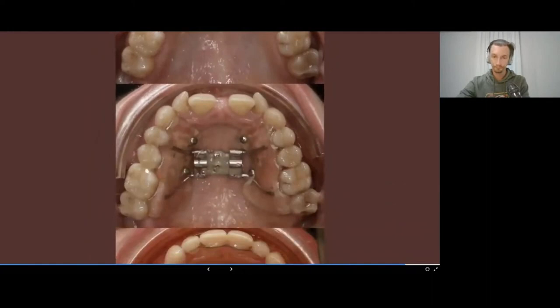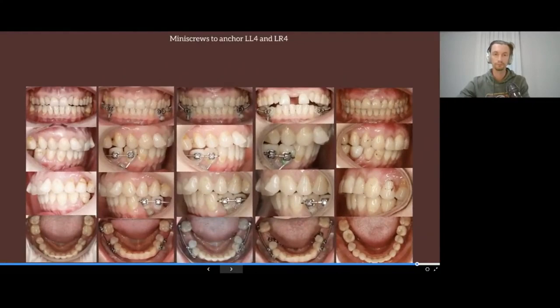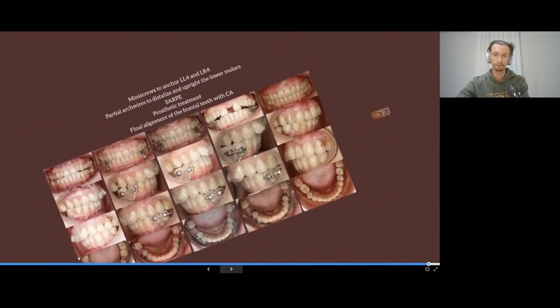During the expansion and the final result: it's only necessary to move the lateral incisors with aligners, and that's it. The stages with mini screws were: stabilize the posterior segments on the lower jaw, distalize second molars on the lower jaw, level them in the occlusal plane, perform surgically assisted rapid maxillary expansion on the upper jaw, restore missing teeth with crowns, and final aligning with clear aligners.